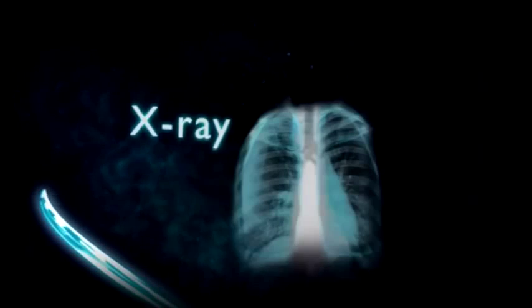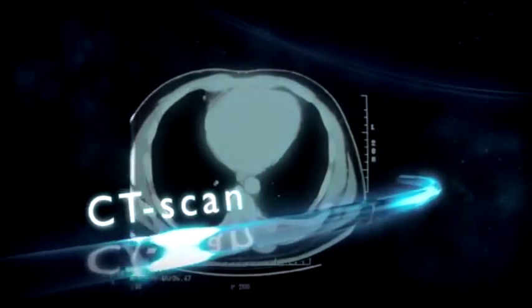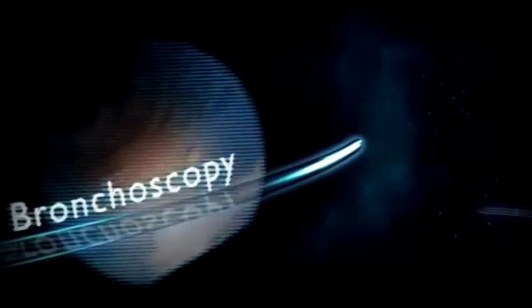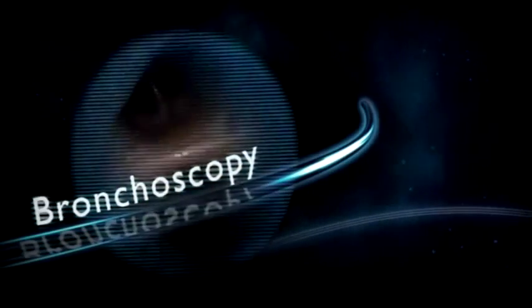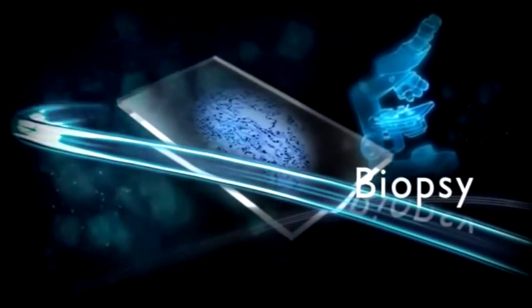How are you currently imaging the lungs? Frozen in an X-ray image? Or under a CT scan? Inside the bronchus using a bronchoscope? Or outside the patient's body analyzing samples under a microscope?